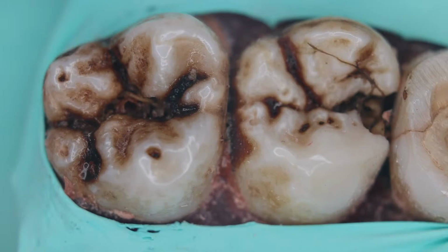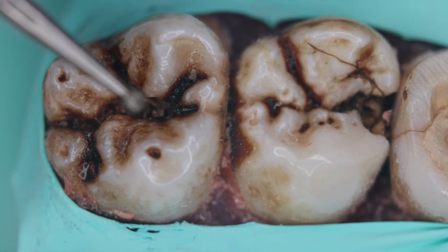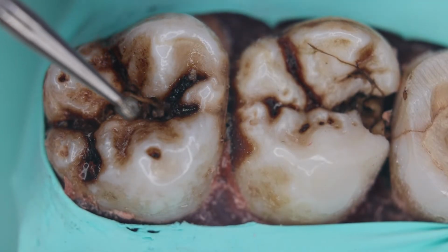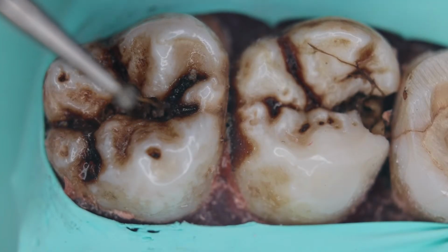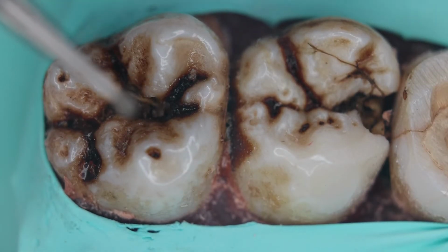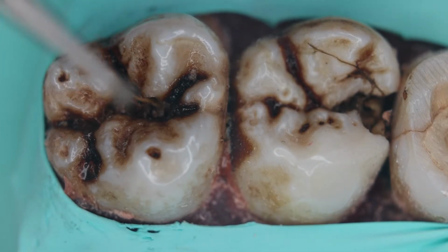what we need to understand is, as per the principles of cavity preparation and considering the clinical situations, how we apply those principles in routine dental practice, that we need to remove all the caries first. Also, we need to get inside the tooth, clearing the defective enamel, the demineralized part of the enamel, and getting into the dentine, and the maximum that we can get is 0.5 to 1.0 mm into the dentine.